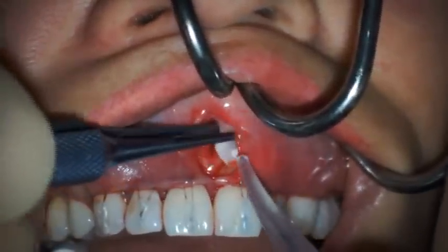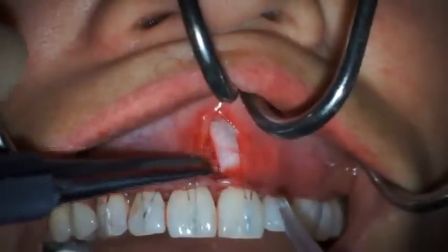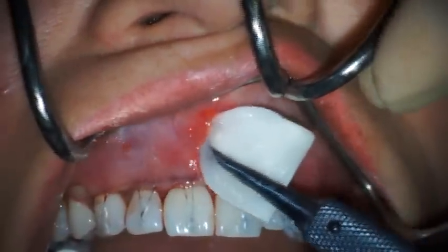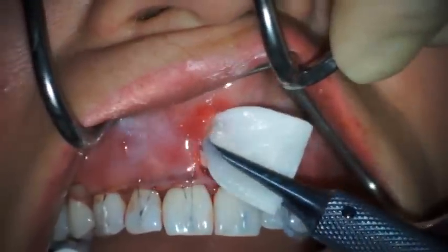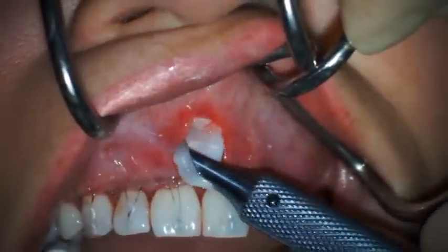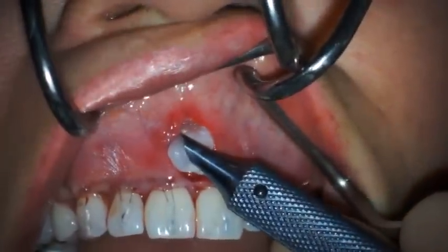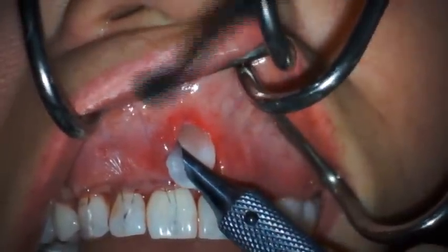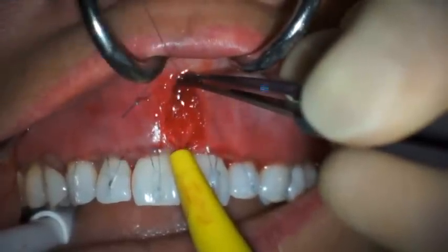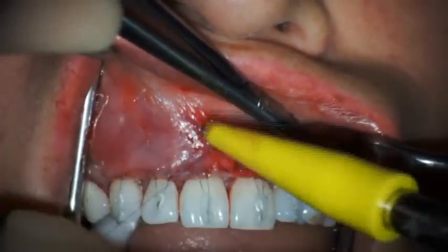The compact layer should face upwards and the spongiest surface should face toward bone. Mucograft should cover all portions of the exposed roots. Excessive pressure should be avoided as it may compress the matrix. After mucograft comes in contact with blood, there is approximately a one-minute window when its position can be adjusted. Beyond one minute, the consistency of mucograft changes and should no longer be manipulated. Following the placement of mucograft, the midline incision is approximated and sutured primarily with multiple 6-0 polypropylene sutures.